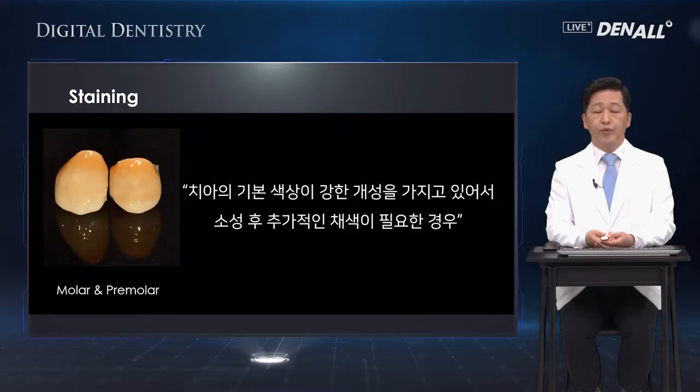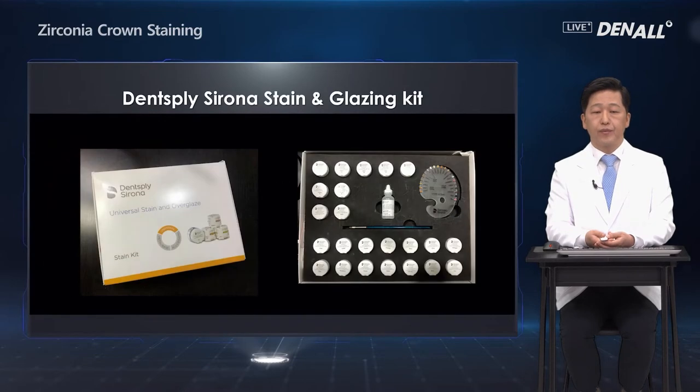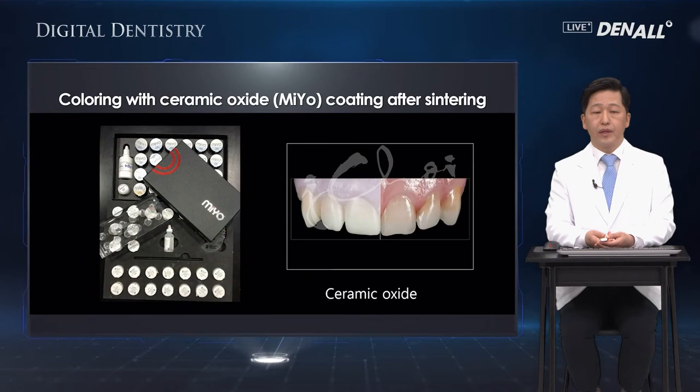The third way to smoothen the surface is staining. This is used when the basic color of the tooth is pretty strong and has character, so additional coloring is required after sintering. This is the Dentsply staining kit, based on the Ceramic Oxide Mio staining kit.